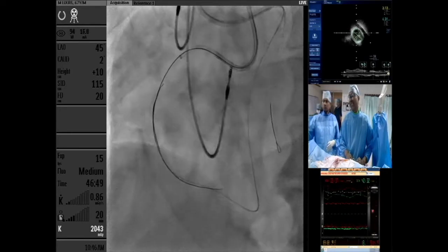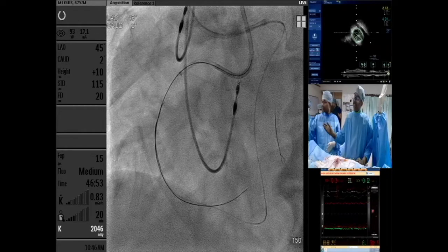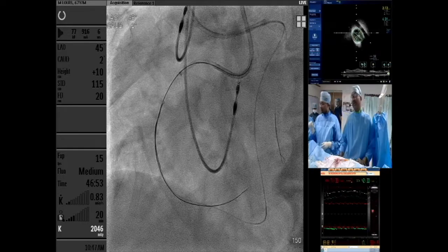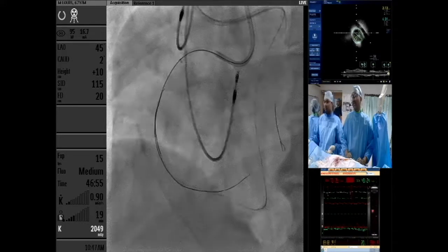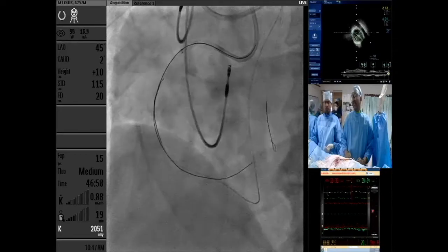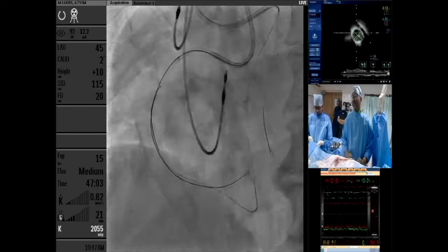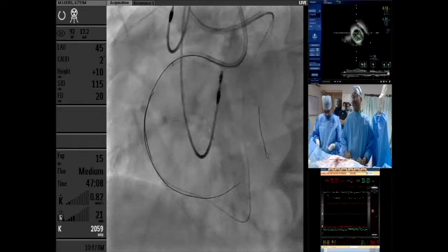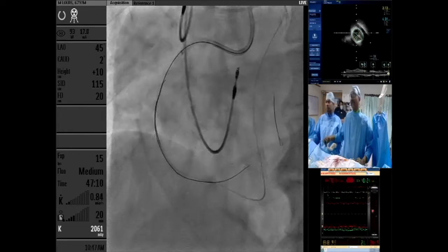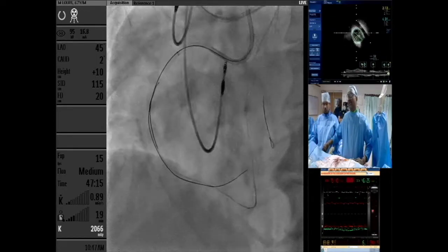Oh, now we can see how the Gaia wire is going down so freely. Give us the microcatheter. So what we'll do is we'll just send the microcatheter down, but the problem is we can't put a trapper here. Generally in microcatheters, carefully we can send without even a trapper in. Yeah. So done. So give me the workhorse wire now.